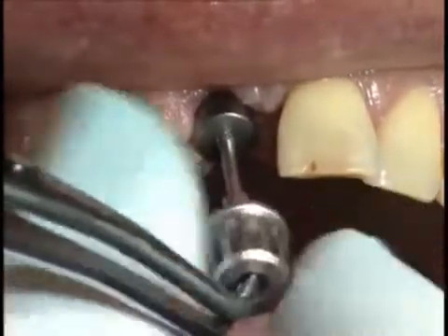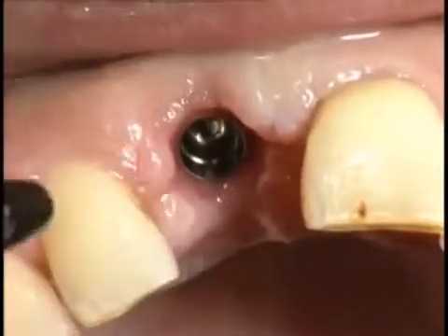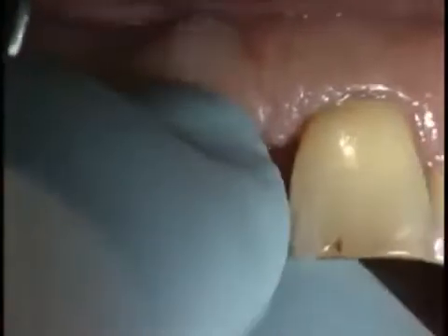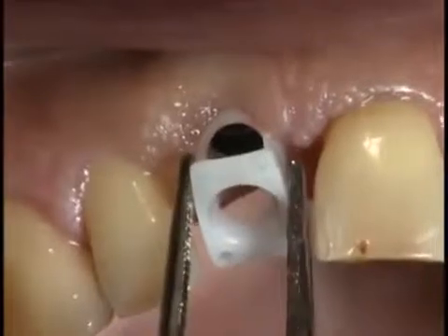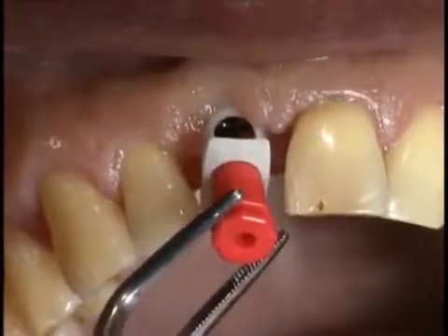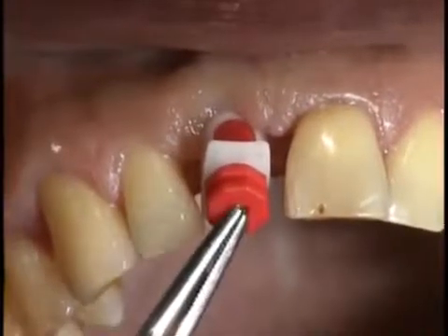For impression taking, the SCS healing cap is removed and the internal threading of the implant is thoroughly cleaned and dried. Then the impression cap is placed on the implant shoulder and snapped firmly into place. The rotation test shows that the impression cap is securely positioned. Next, the positioning cylinder is aligned inside the impression coping and inserted as far as it will go. There should be no gaps between the impression coping and the positioning cylinder.